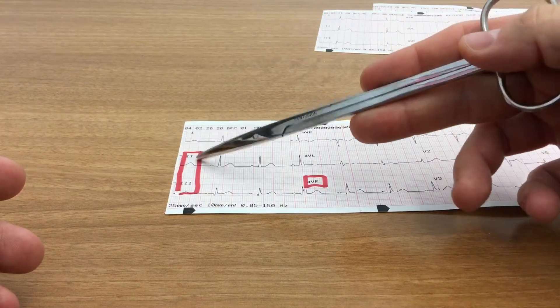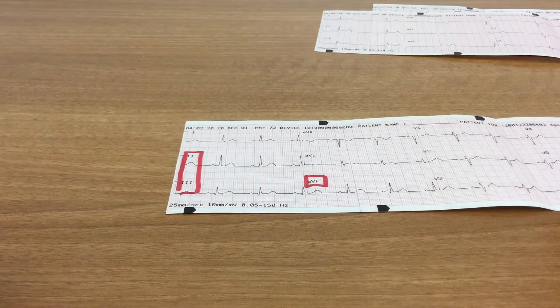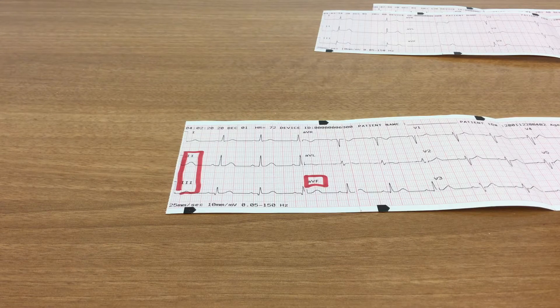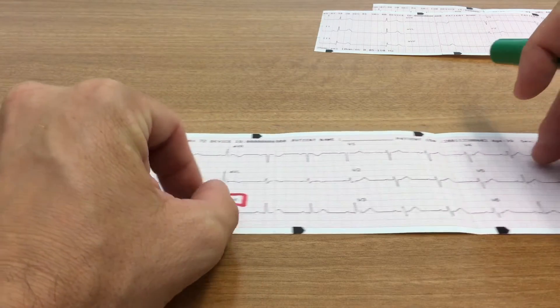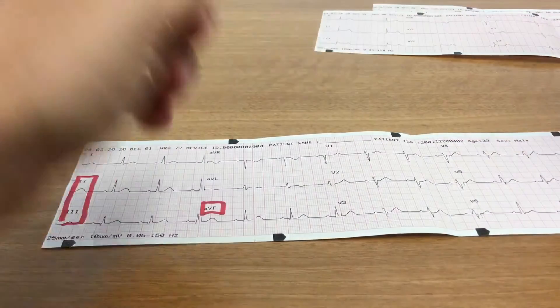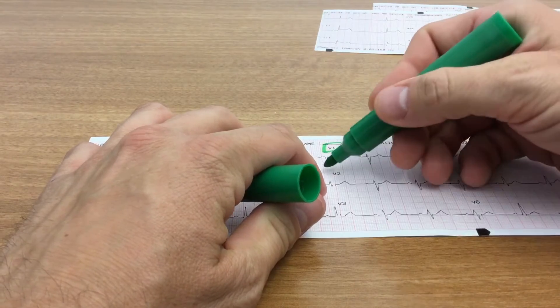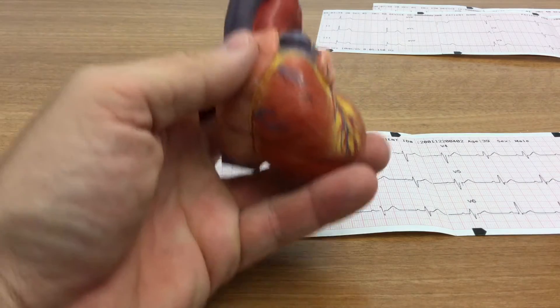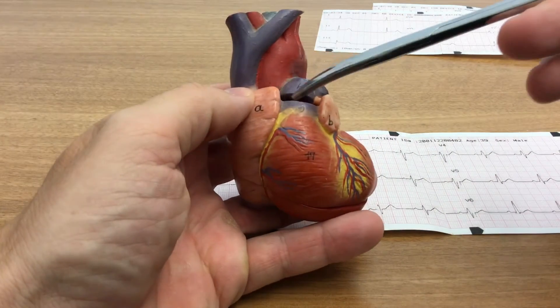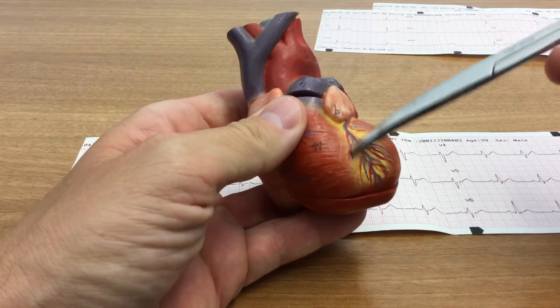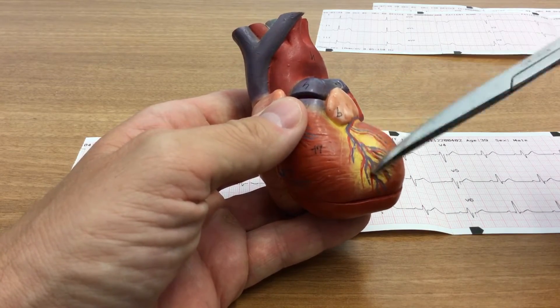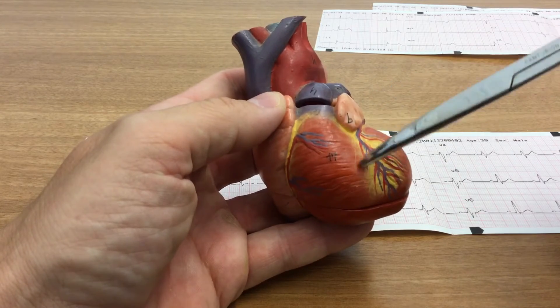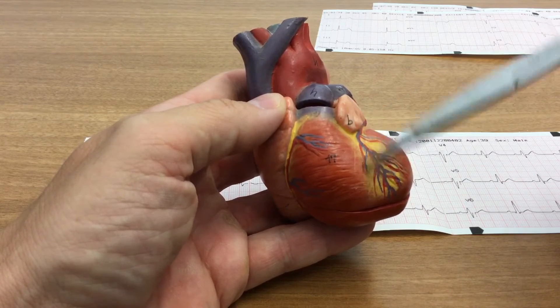So I, inferior wall, 2, 3, AVF. Okay, so the next one that we're going to move on to is the septal wall, the S. And the septum is represented by leads V1 and V2. So if we look back at our heart again here, that's the left coronary artery. Specifically, it is the left anterior descending branch of the left coronary artery. It's actually going to be relatively high up on the LAD, and then you have your septal wall right here.